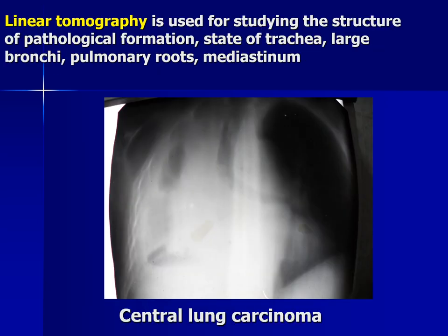Linear tomography is used for studying the structure of a pathological formation, state of trachea, large bronchi, lung roots, and mediastinum. Here is the image of central lung carcinoma. We see a frontal slice of the patient — we see the trachea, its bifurcation, and the left main bronchus is clear. The right main bronchus is blocked by tumour and we see the absence of gas in the right lung.